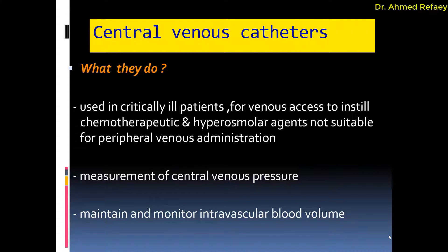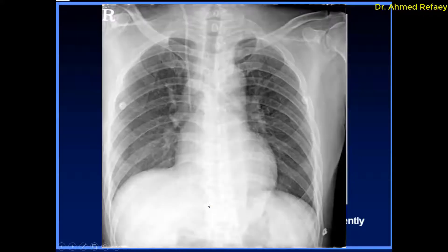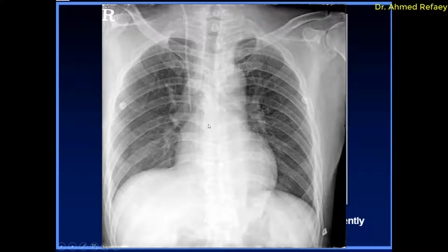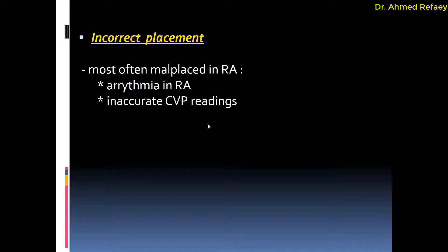Regarding correct placement of the central venous catheter, it has to descend lateral to the spine — this is very important — and its tip has to be in the region of the superior vena cava. As you see in this image and on this plain X-ray, this is an example of correct placement of a central venous catheter inserted through the right internal jugular vein, descending parallel to the spine on the right side with its tip in the region of the superior vena cava.